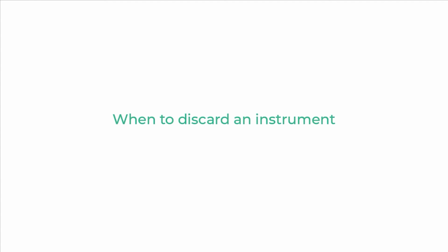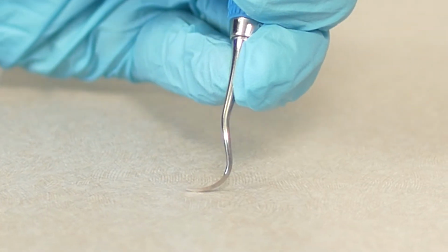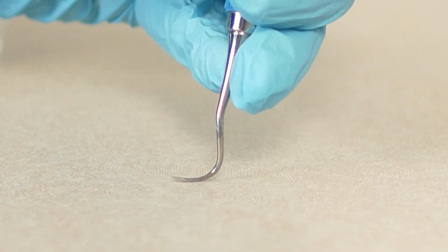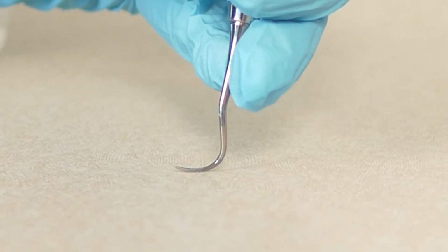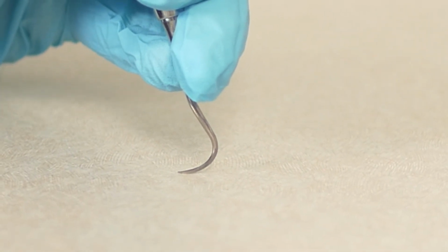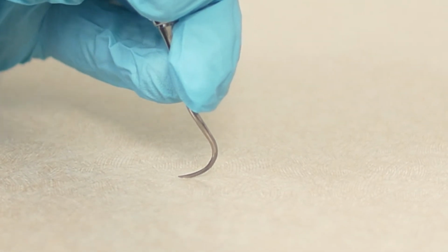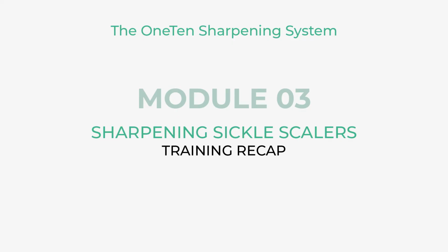When should we discard an instrument? It's not always easy to determine when to discard an instrument. This has always been a difficult question to answer because we all love our thinner instruments. If the instrument flexes at all by pressing it against a hard surface, like the countertop, discard it. If it flexes at all during sharpening, discard it. If it flexes while scaling, definitely discard it. You do not want the risk of the tip breaking off in the sulcus during use.